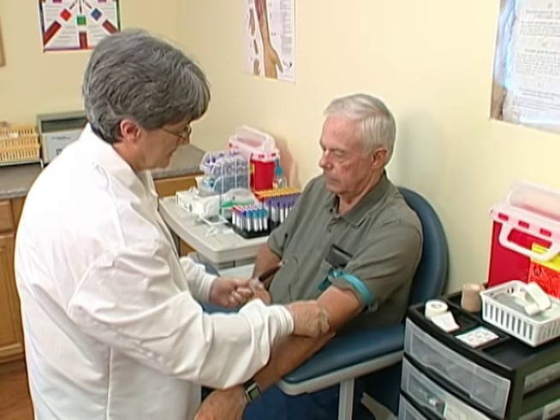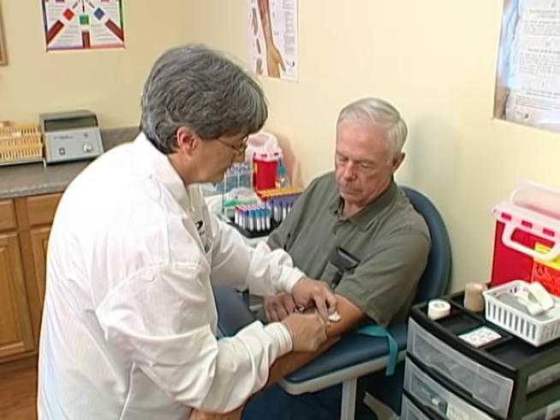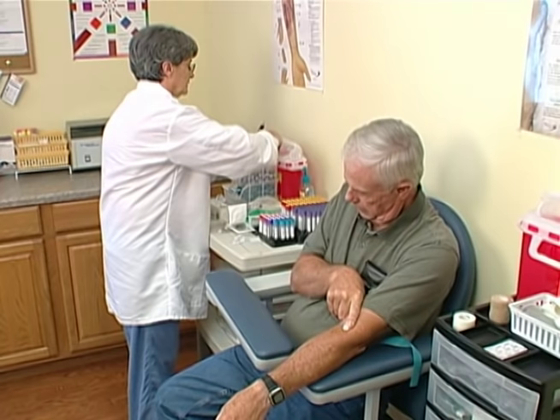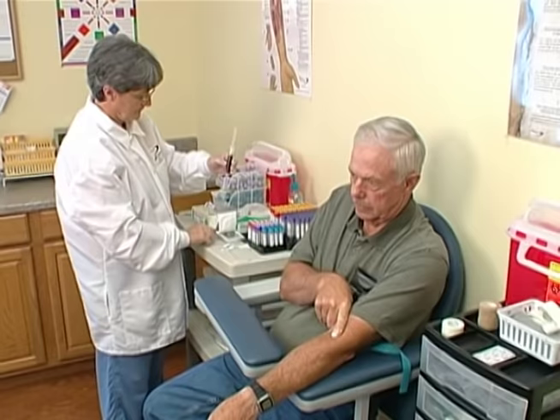Release the tourniquet and place a clean gauze pad over the insertion site. Remove the needle and apply pressure, immediately activating the needle's safety feature according to manufacturer's instructions. Remove the set from the syringe and attach a safety transfer device. Discard the set according to OSHA guidelines and your facility's policy. Fill the tubes in the correct order of draw, inverting each tube after filling.